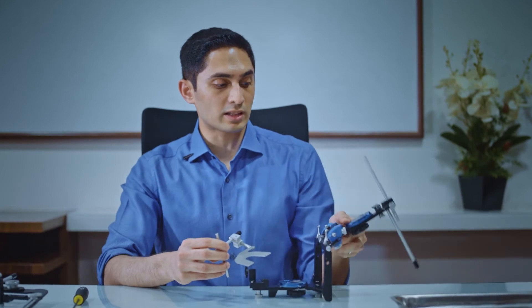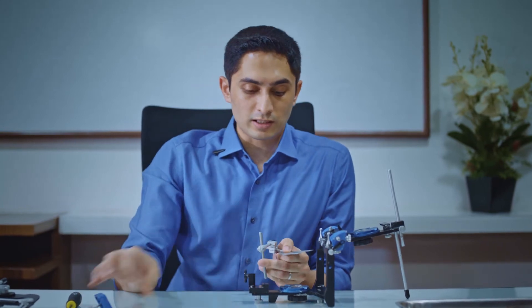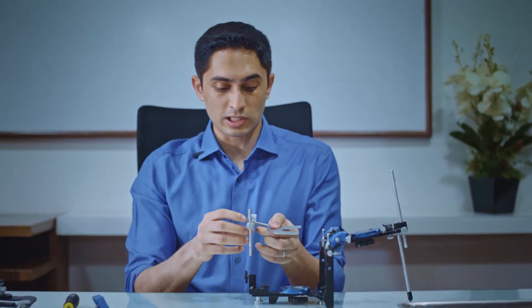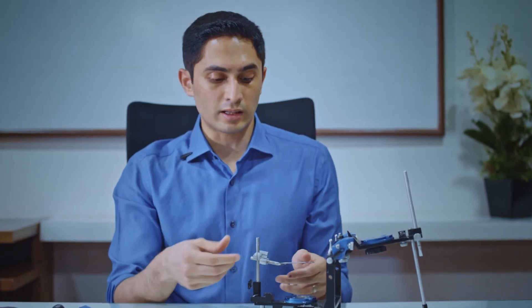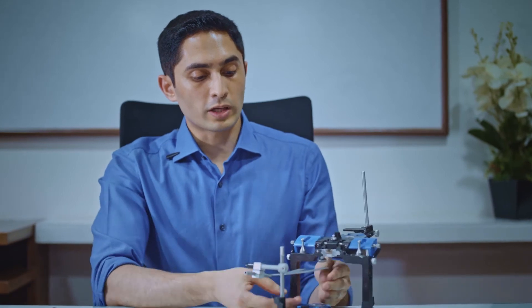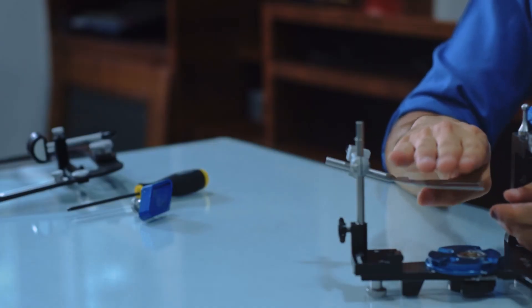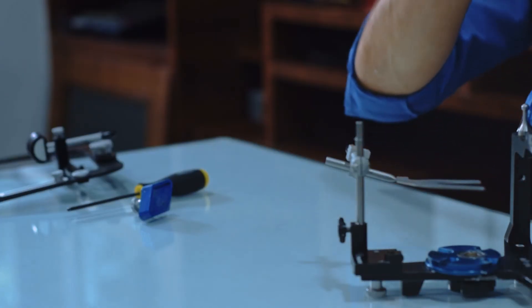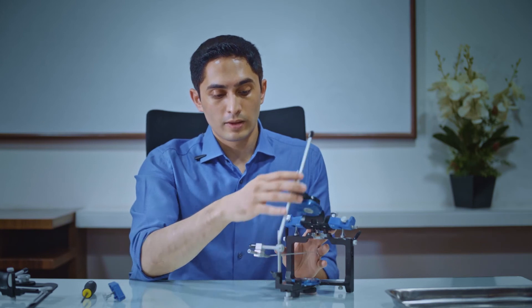On the Panadent PSH articulator, I've already removed the custom incisal guide table and replaced it with the face bow mounting jig. Component names vary from company to company, but you essentially get this into place and tighten it. They also provide a little support — similar to what Hanau does — to stabilize the bite fork. Then you mount the upper cast, close the articulator, add some plaster, and that's the end of your face bow mounting.